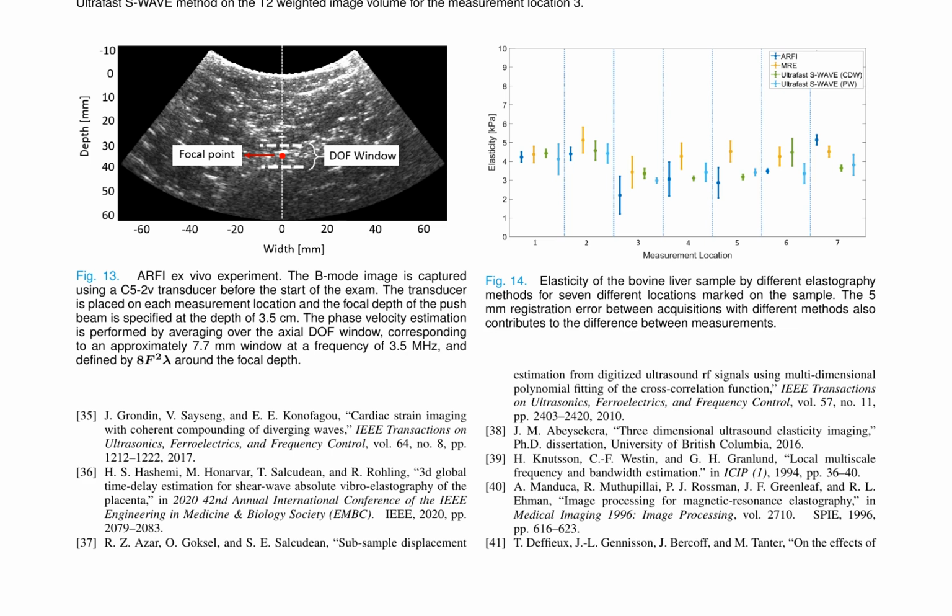For instance, in the context of cancer research, the overlay of elasticity volumes on T2 weighted images could help identify areas of abnormal tissue stiffness, potentially indicating malignant growths. Furthermore, this approach can also be applied to other imaging modalities, such as computed tomography, CT, or ultrasound, to provide a more comprehensive understanding of tissue properties and their relationship to anatomical details.